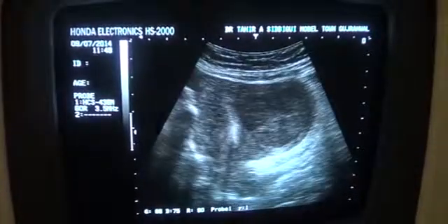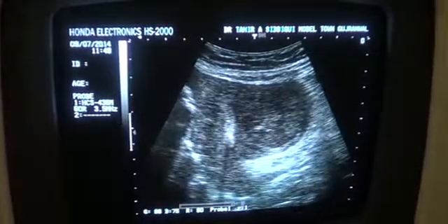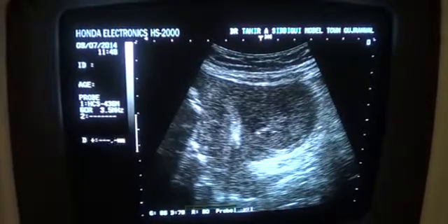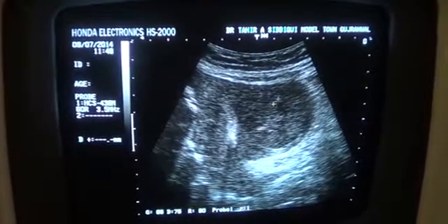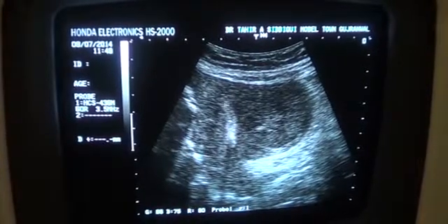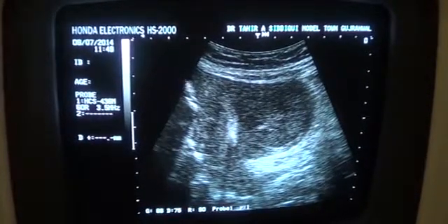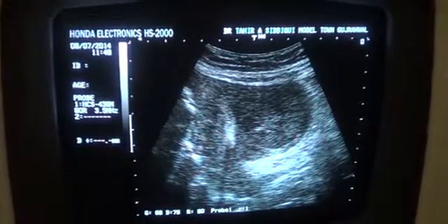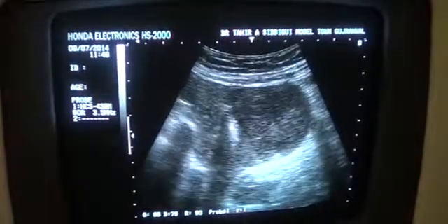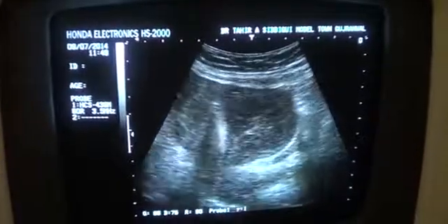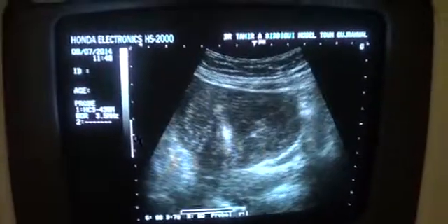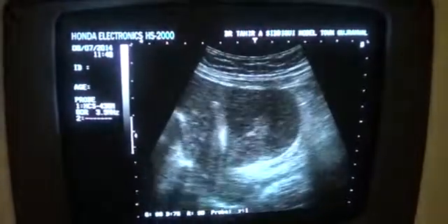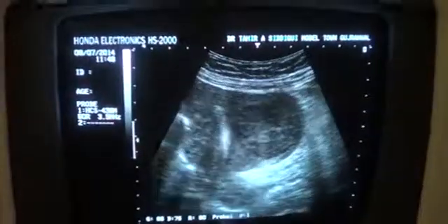Here you see the myoma again in the longitudinal section, the IUCD, and the uterus. This is our case of the day — thank you very much.